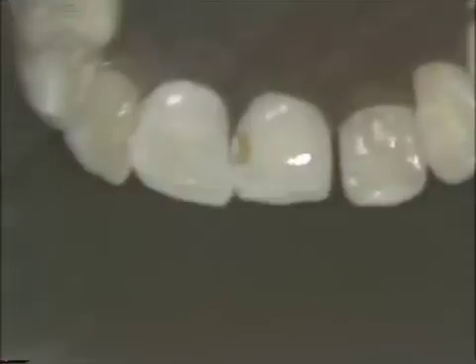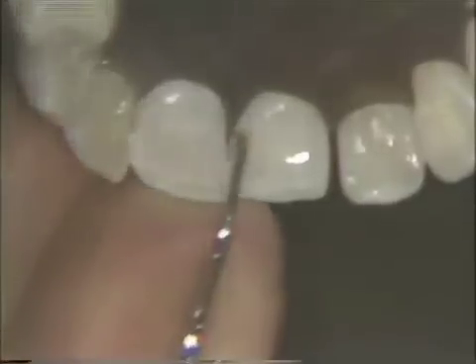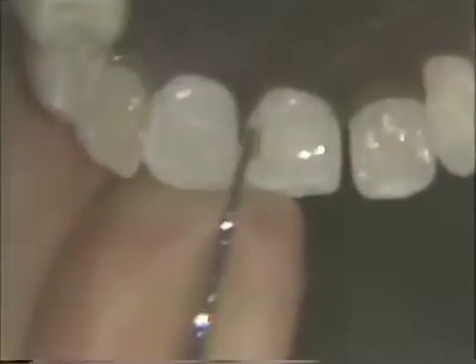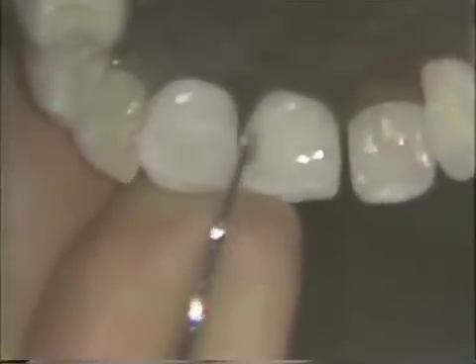Now we are in with a hoe that we will sharpen up that labial wall and the incisal wall and the cervical using the hoe. A scraping motion.